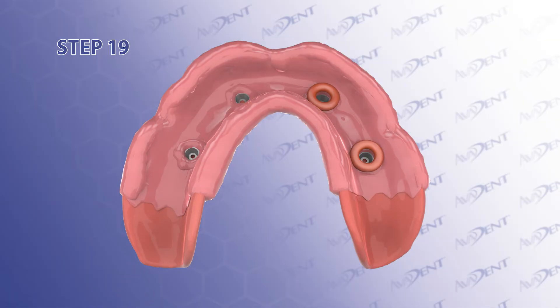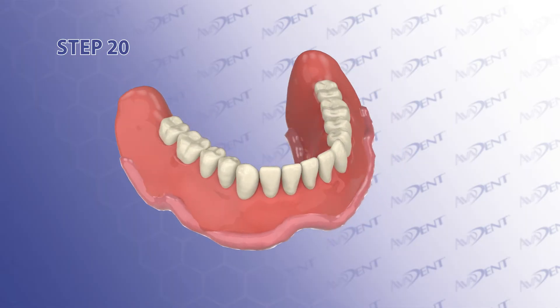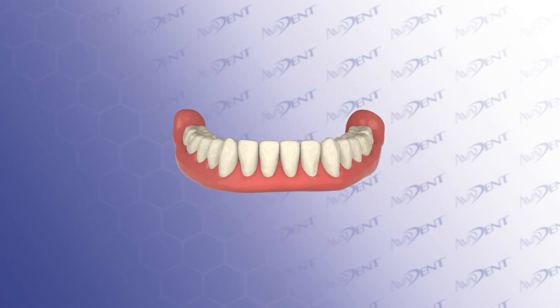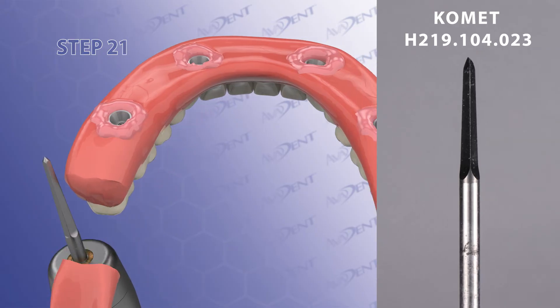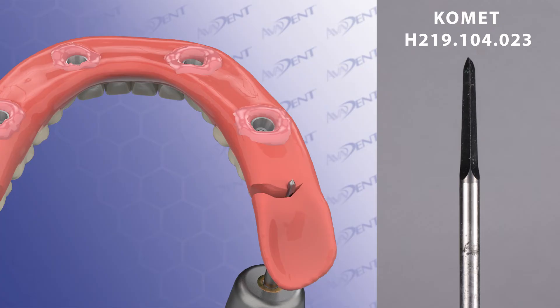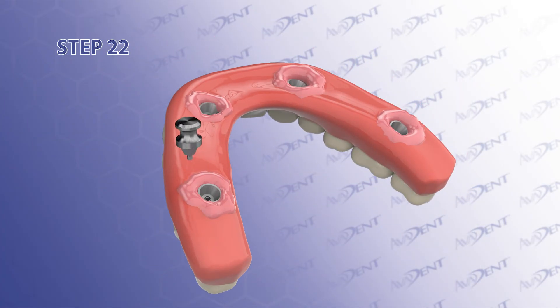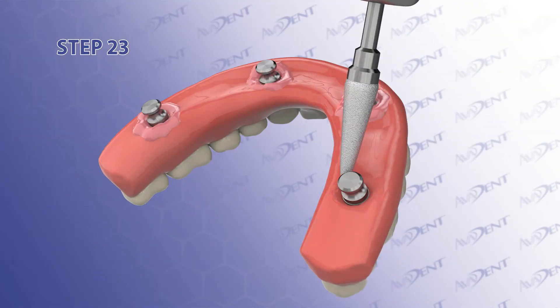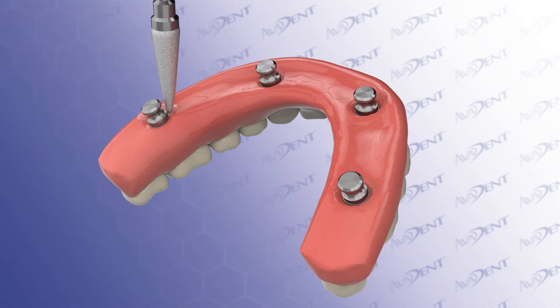Step 19. Remove the dam donuts from the denture intaglio. Step 20. Remove the denture flanges and rough-cut the fixed complete denture contours. The ideal is to establish convex contours for optimal home hygiene. Step 21. Cut the distal heels quickly with a wheel or carbide number H219.104.023 from Comet. Step 22. Place protective plugs to cover the mating surface of the tie base. These plugs simply push into place. Step 23. Clean around the tie bases with a narrow carbide or number 8 round burr. If necessary, salt and pepper with acrylic to fill any voids.